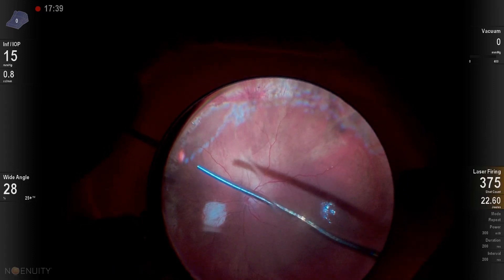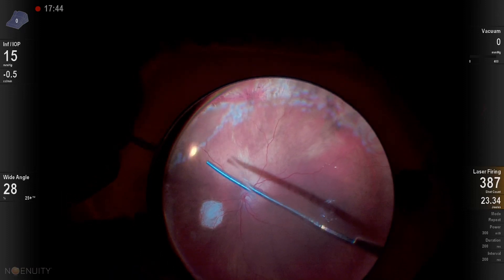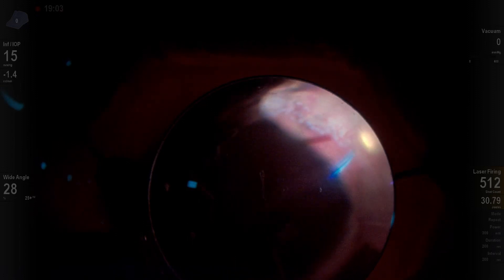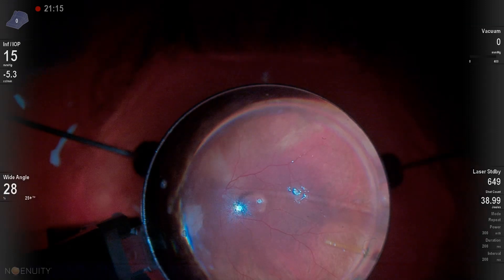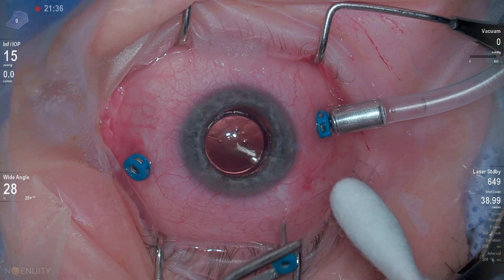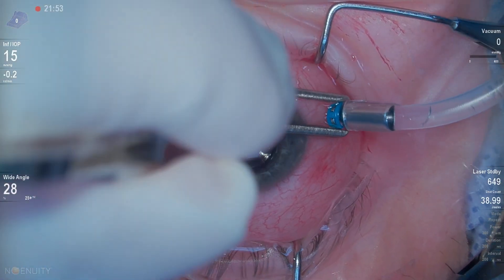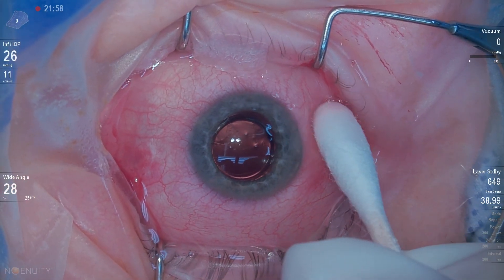So I laser on my draining retinotomy. There is still some residual fluid there, but I know that's going to likely go flat under my perfluoron as I leave that PFO in for two weeks. This can cause some inflammation in the eye, so I put the patient on topical diflupredinate drops four times a day. I want to be sure to have a full PFO fill — so even if I have to open another vial of PFO, it's worth it to not get an underfill. The beauty of this is it can be sutureless. The patient can be on their back or upright for the two weeks while that inferior detachment heals, and then we'll go back in and remove that perfluoron two weeks later.